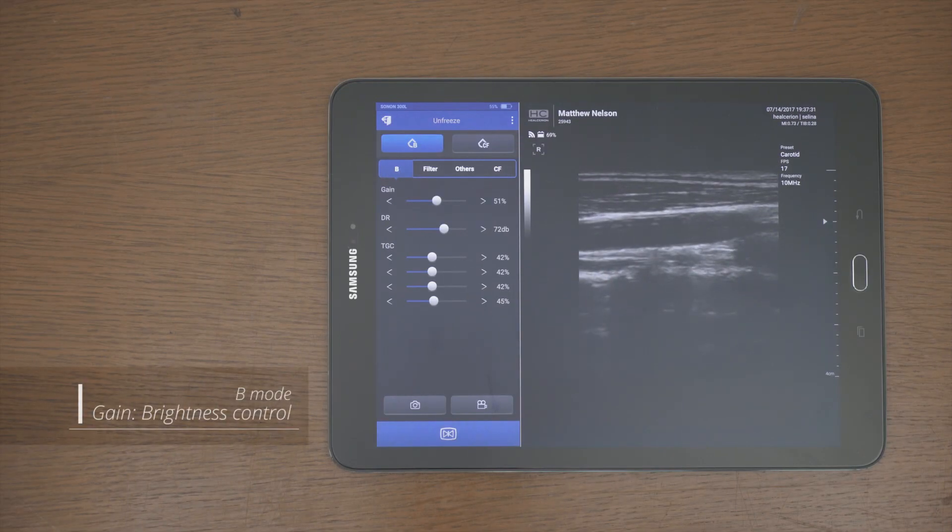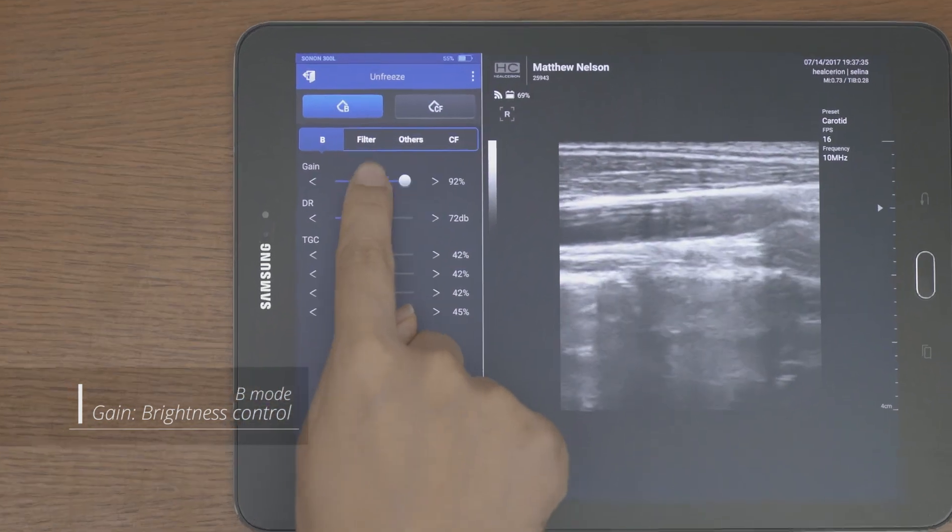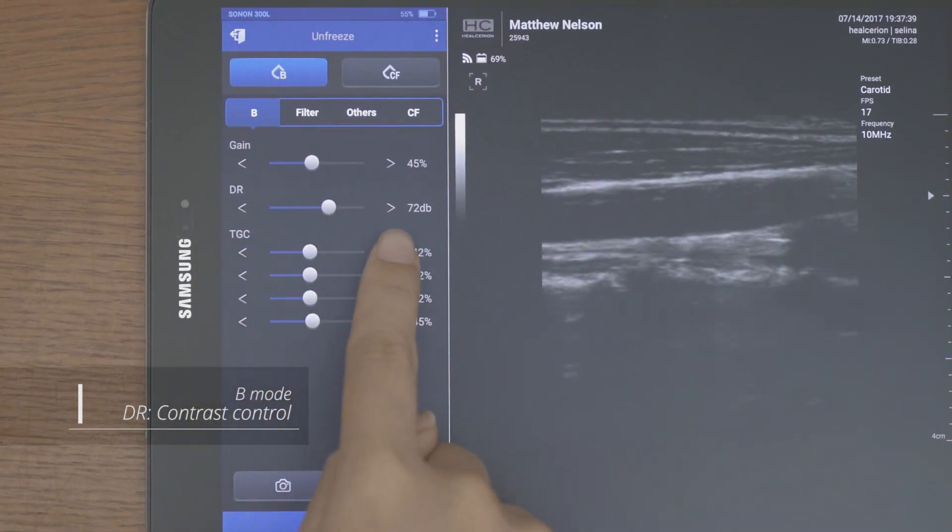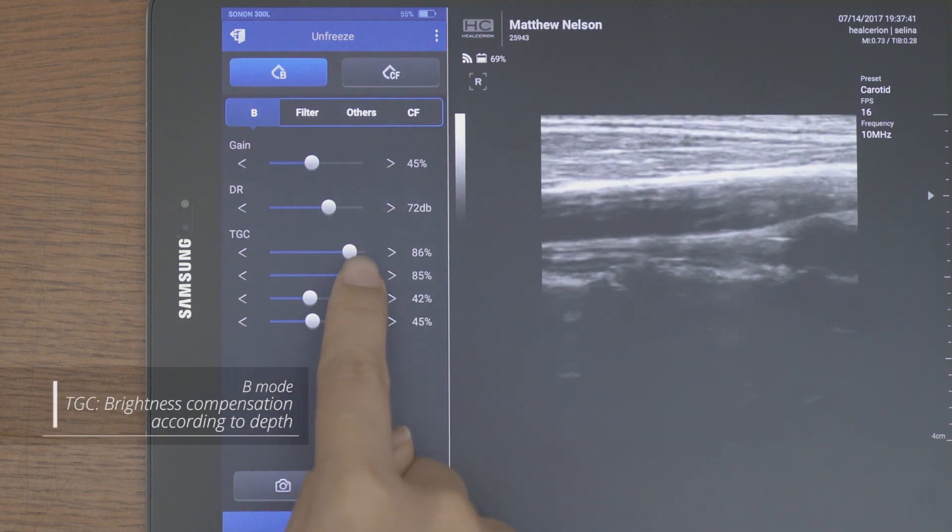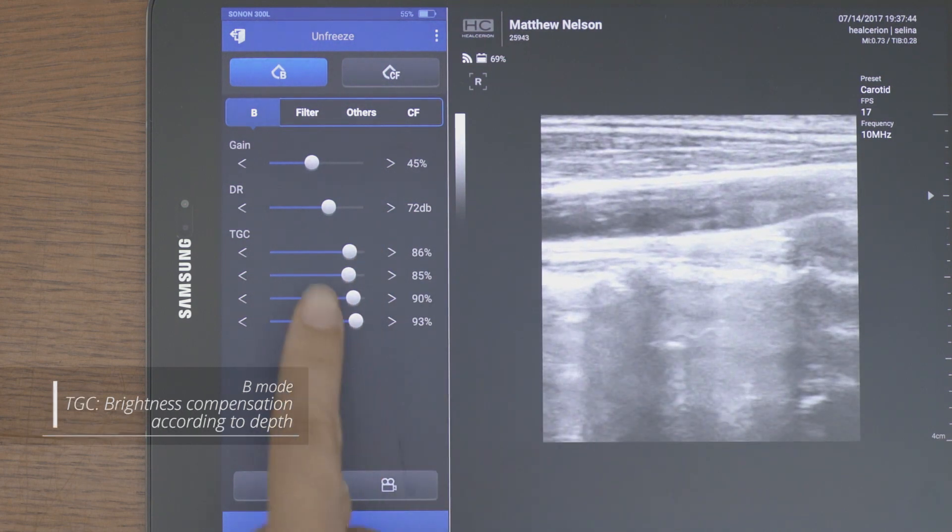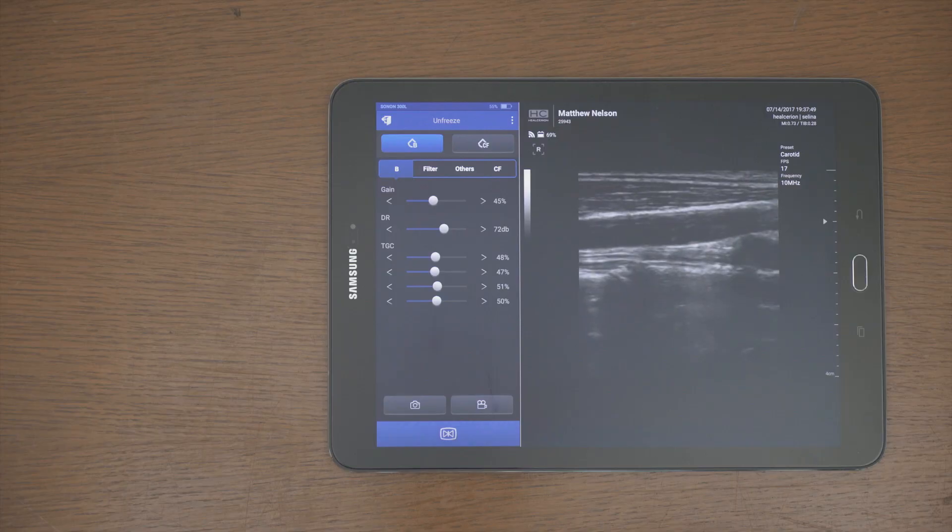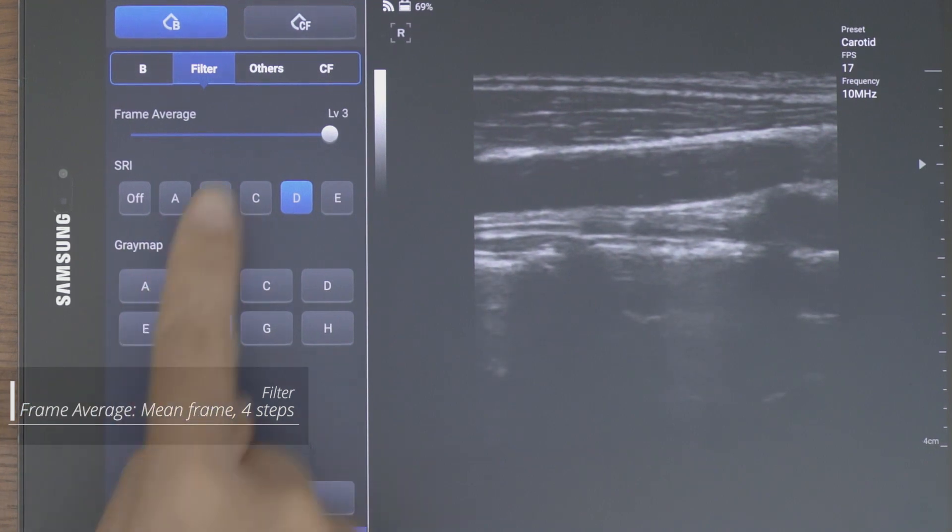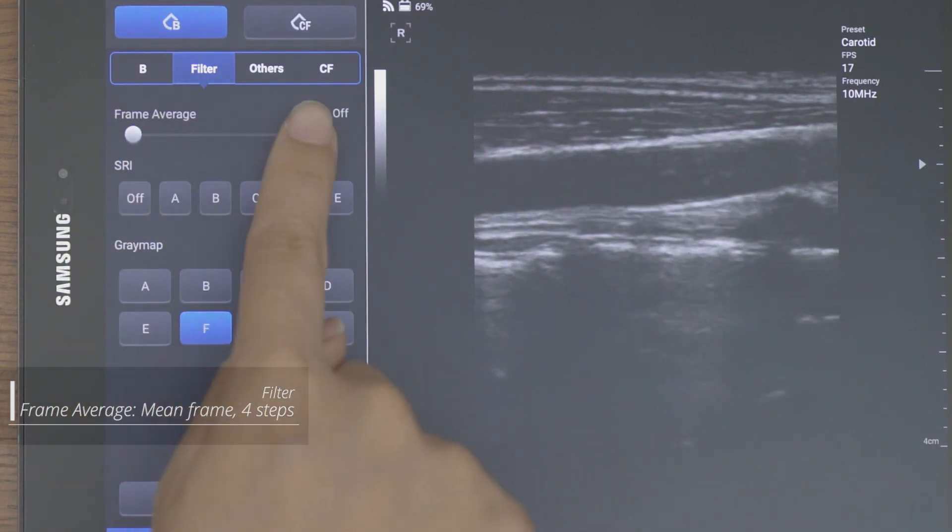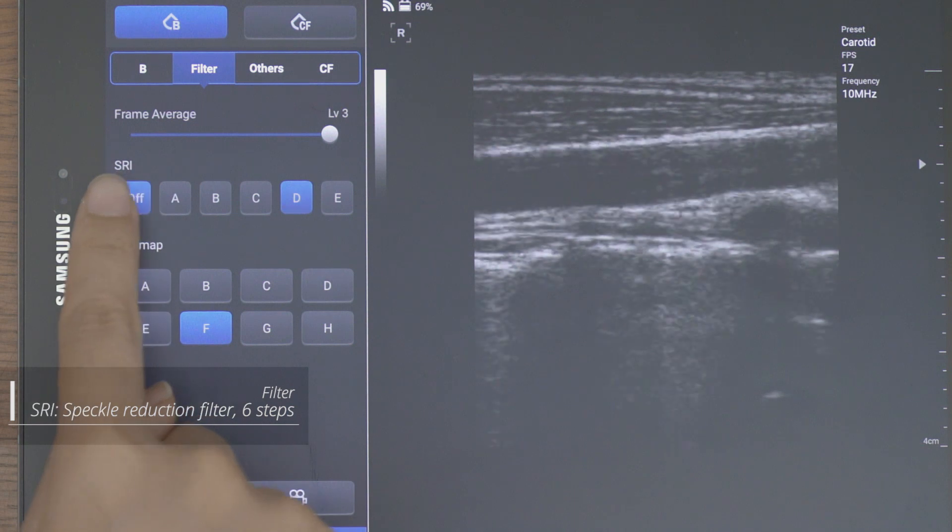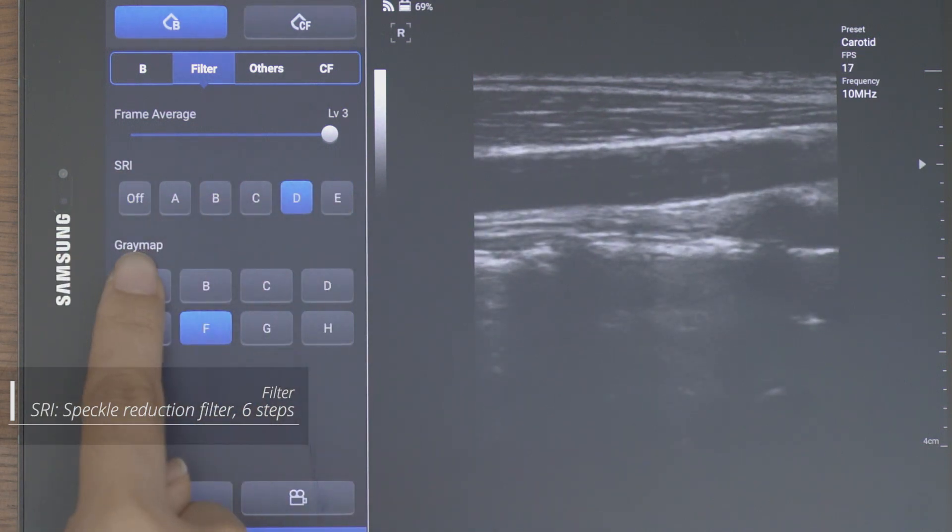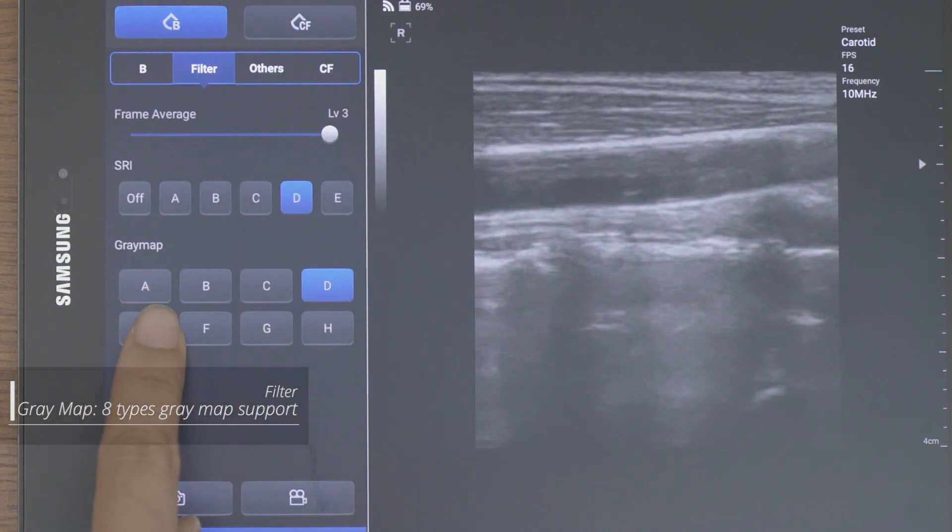You can adjust the image parameter values while scanning. There are gain, DR, and TGC functions in the B mode. Frame average, SRI, and gray map can be set in filter settings.